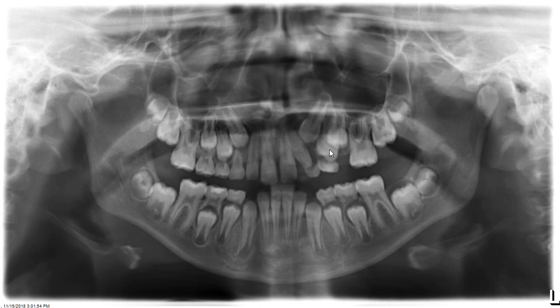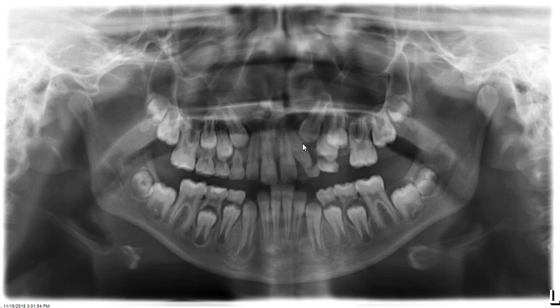So we have a lot going on: crowding and a canine that is likely impacted and has caused displacement of the lateral incisor, which prevented it from fully erupting. Like the case I shared earlier, this could certainly cause resorption of the lateral incisor down the road — so that is something we have to watch out for.